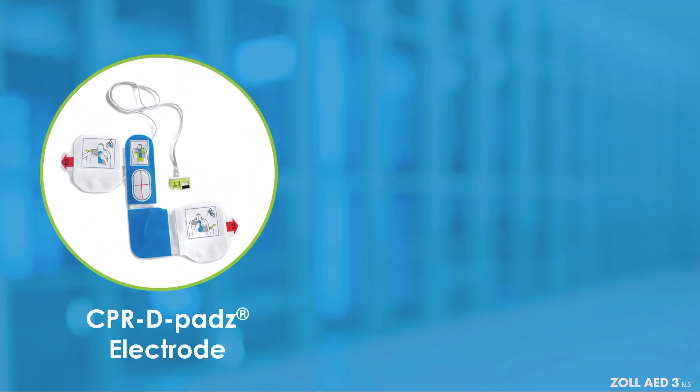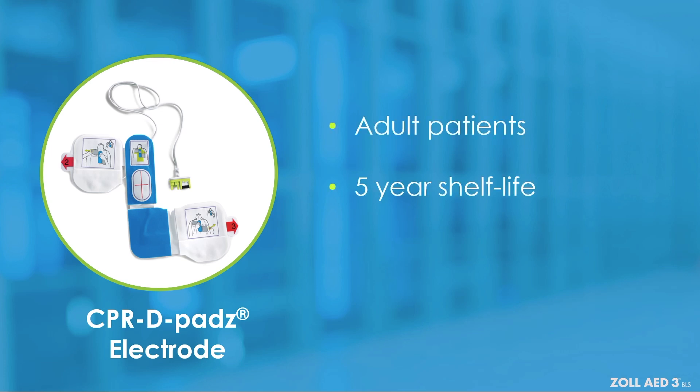The CPR D pads electrode can also be used with the Zoll AED-3BLS. It is intended for adult patients and has a shelf life of five years. These pads also include a CPR sensor that provides compression data to the AED on CPR rate and depth.